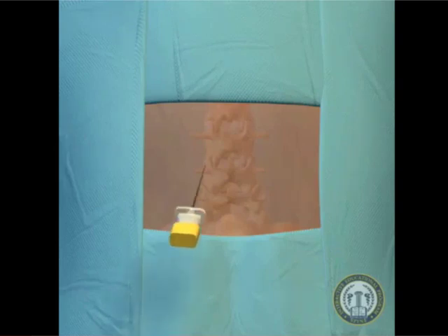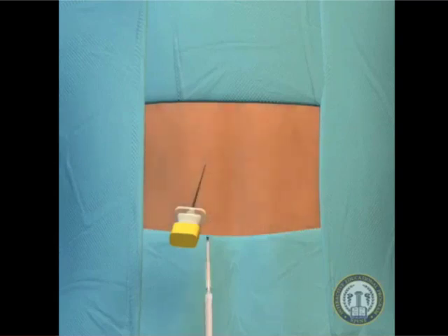After the patient is draped, a 22-gauge spinal needle is inserted into the skin directly over the ipsilateral disc space of interest. The needle is used to identify the trajectories of the screw placement and to ensure an accurate extent of the incision. For a single-level procedure, a 2.5 cm skin incision is centered over this point.